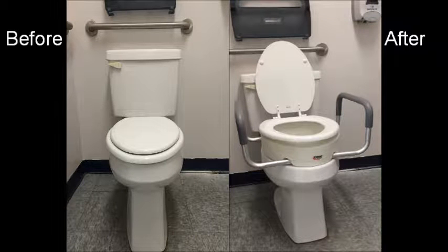The raised toilet seat is a device that can be attached to your toilet in order to raise the height of the seat. This device is useful for increasing safety when getting on and off the toilet.